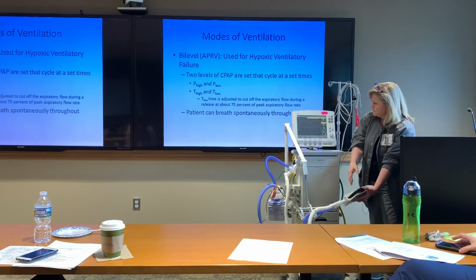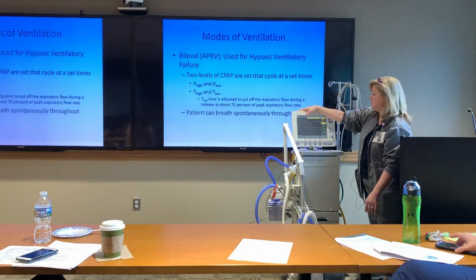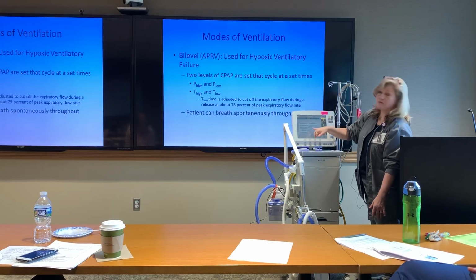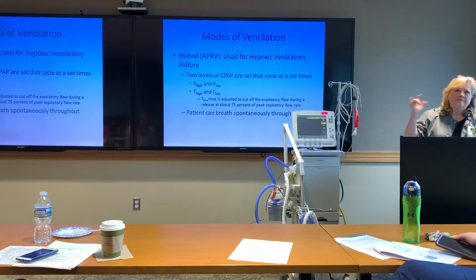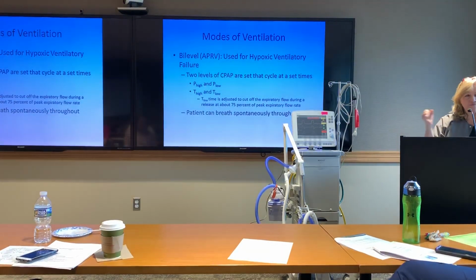but it really has specific uses for hypoxic respiratory failure, hypoxemic respiratory failure, whatever. Low PF ratios. If that doesn't work, then ECMO is pretty much what we consider, because if they're not recruitable, there's not much else you can do. PaO2 to FiO2: I talked to you guys about the ratio, and it's just your PaO2 divided by the FiO2, which is always 0.5 or 0.7 or point whatever. Our favorite FiO2 is either 100 or 50, because then I can just multiply by 2, or I don't have to do anything. If I'm on 100%, my PF ratio is whatever my PaO2 is, right?